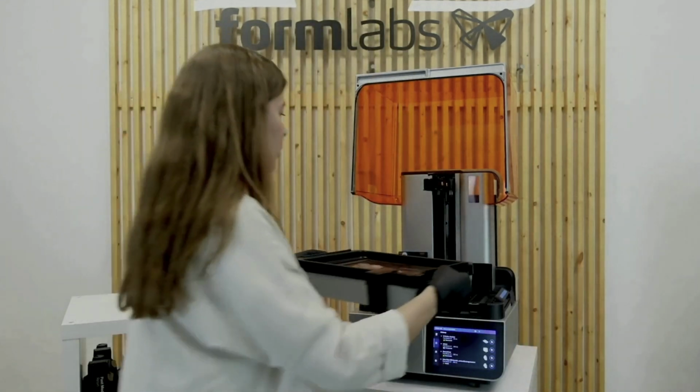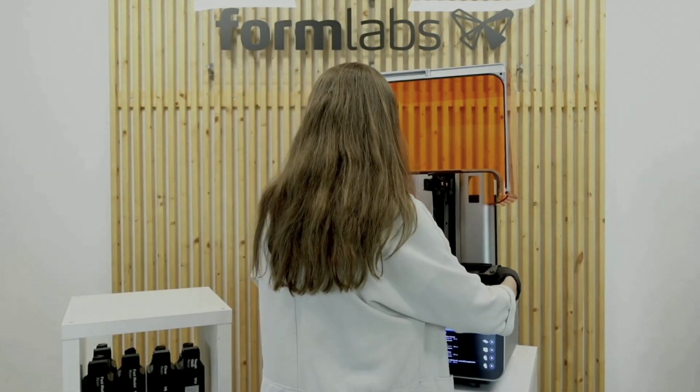This enables me, for example, when I'm done with a print job, to take the tank, put the plastic lid on, store it on the side, and change and swap materials very easily. So what I'm going to do now is place the tank in the printer. You can remove the plastic lid outside, or place the tank with the plastic lid on. That's what I'm going to do now.